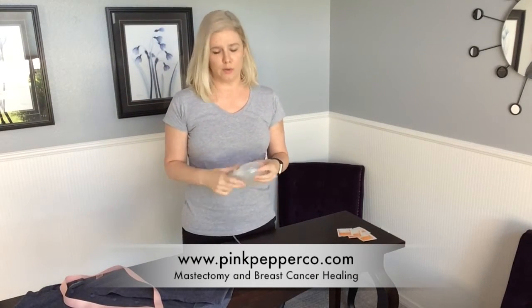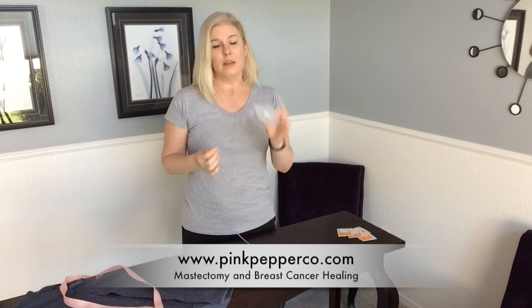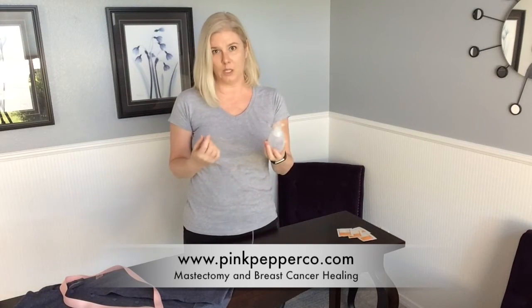Wanted to do just a quick overview of a JP drain. Anytime you have a breast surgery like a mastectomy, they usually install some sort of drain, 2 or 3 on each side, maybe 1 on each side.